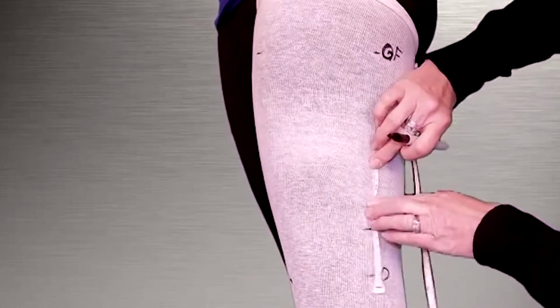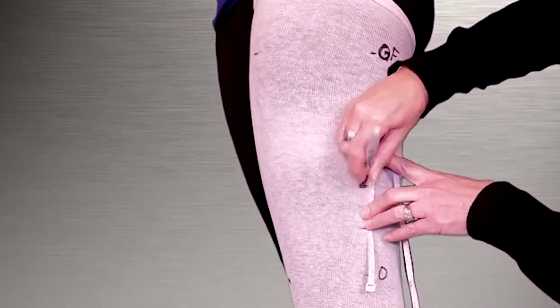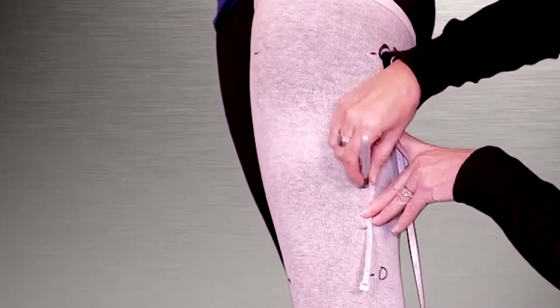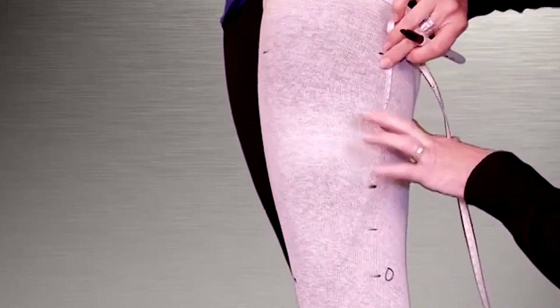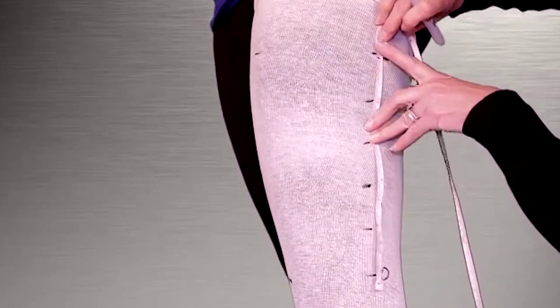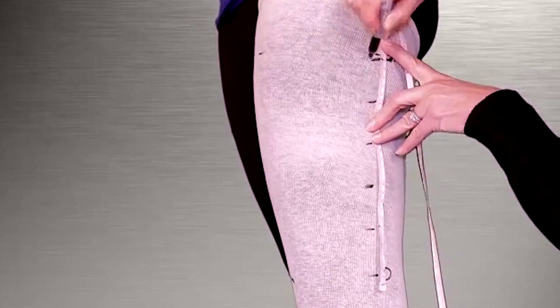Repeat the process for the upper leg, starting at the 0 point on the lateral aspect of top of patella, and make a mark every 5 centimeters moving up the leg until you reach the gluteal fold. We are now ready to measure and record the garment lengths.